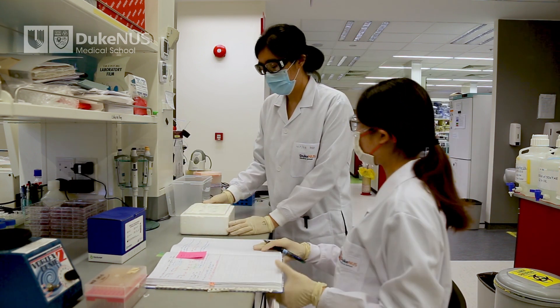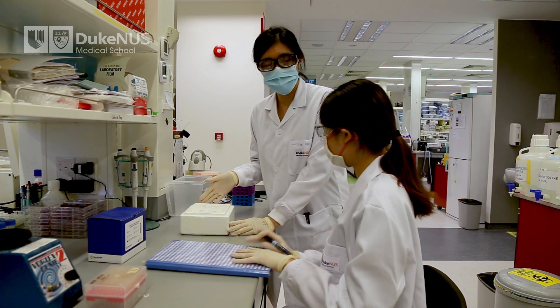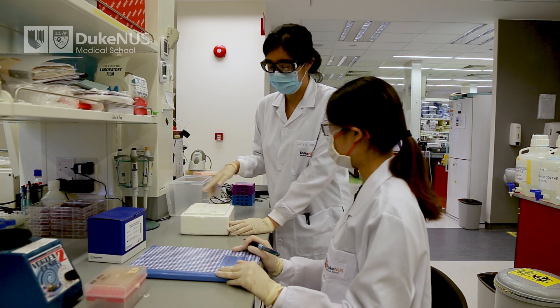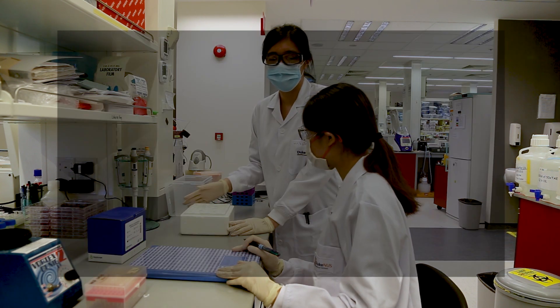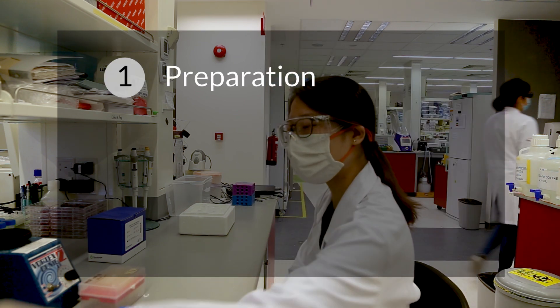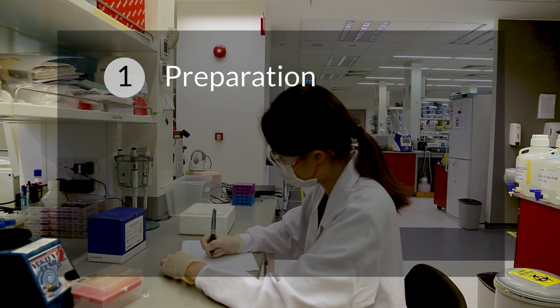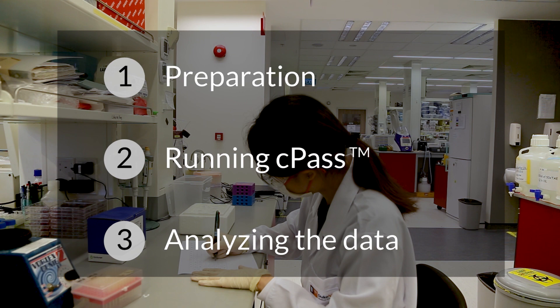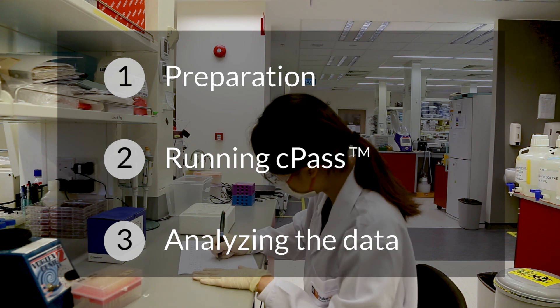Running cPass is like running other serological tests such as ELISA. The whole process involves three main steps: first, preparation, which includes planning your experiment and making stock solutions; second, running the experiment; and third, analyzing the data.